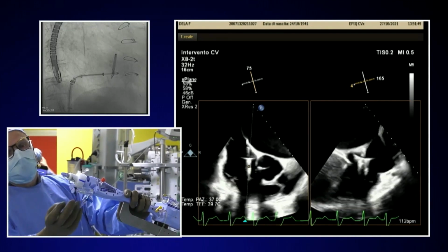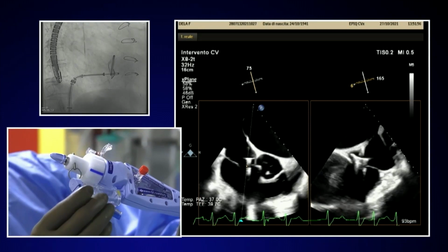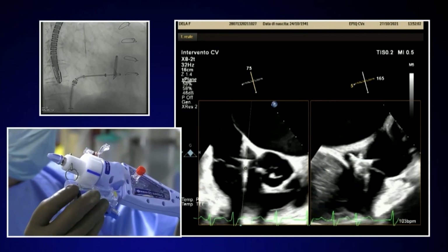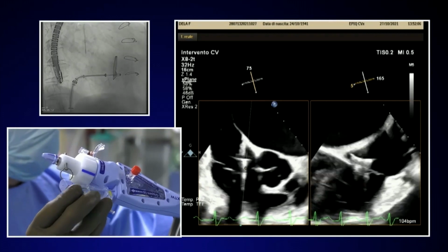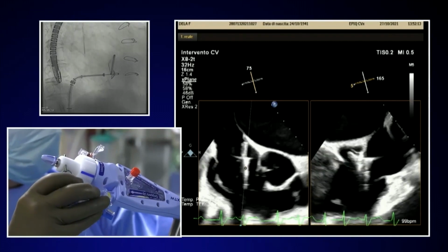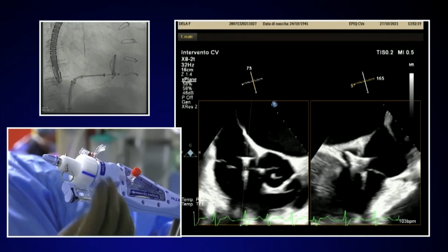So this is an important step for the G4. We can identify the septal gripper from the anterior gripper. So let's see, I move. This is going to be the anterior, as you can see here. And this is going to be the posterior, the septal. So the septal is the one with the dot. And now we'll put them together again.